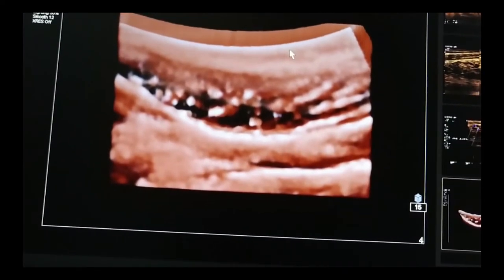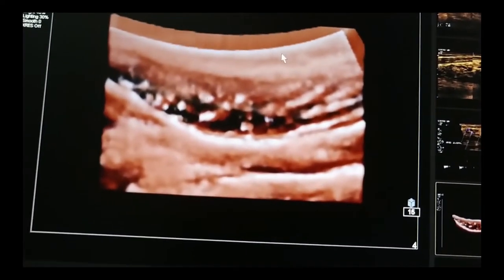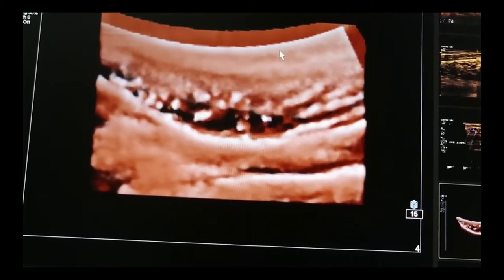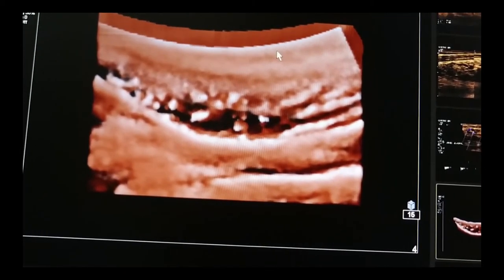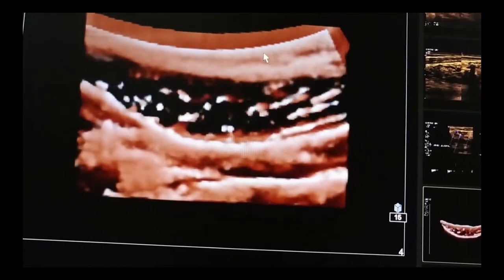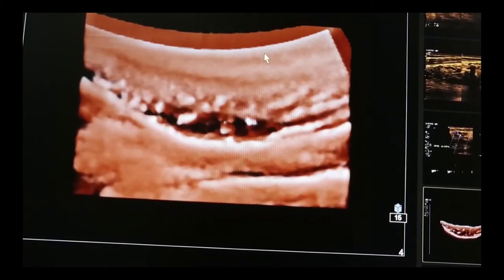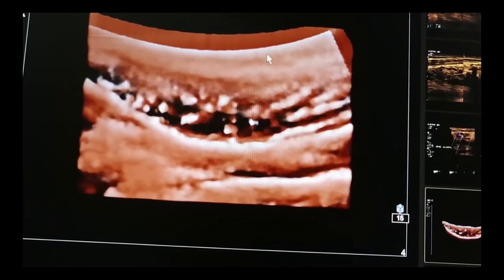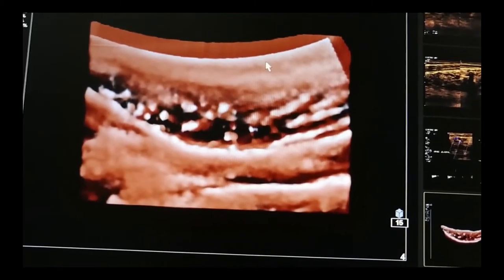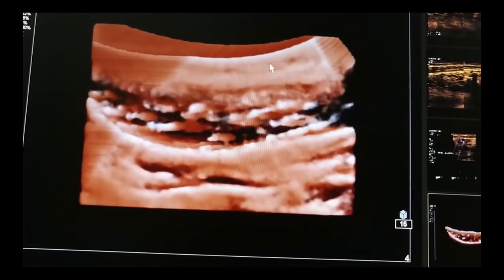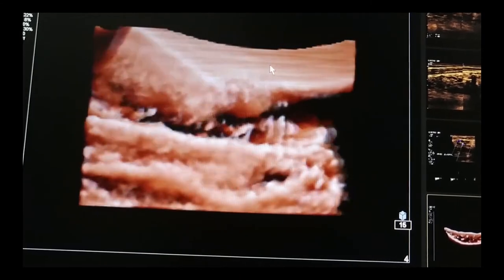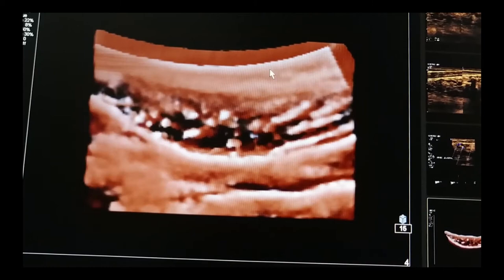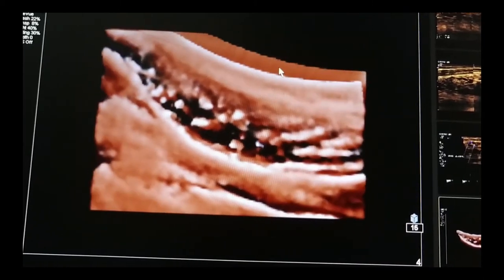Now I am changing the smoothing — from smooth to a detailed one. Now I am changing the threshold, decreasing and increasing it to have a better view. I am rotating the image for a better view and trying to see whether the threshold level is OK or not.